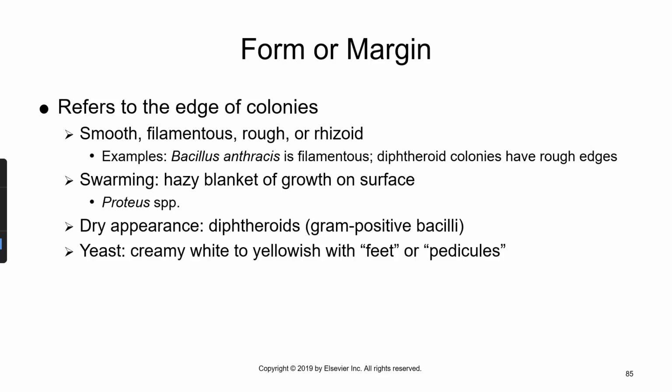Proteus does swarming. When you get Proteus in a lab, it's kind of a pain. We have to grow it by itself if we suspect that it's Proteus, because Proteus will literally swim over and take over the entire plate. When we do certain antibiotic susceptibility testing, we always do a purity plate to make sure that the culture we're growing is pure before we evaluate whether it's susceptible or resistant to an antibiotic. If you have a Proteus species, it has to go on its own purity plate. You can never put it with other organisms because it will swim all over the plate.